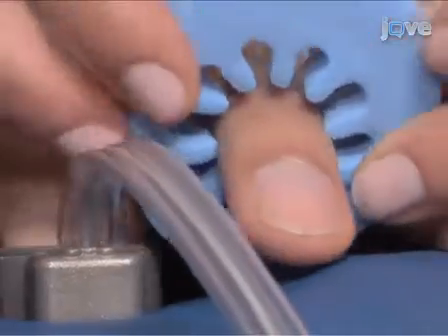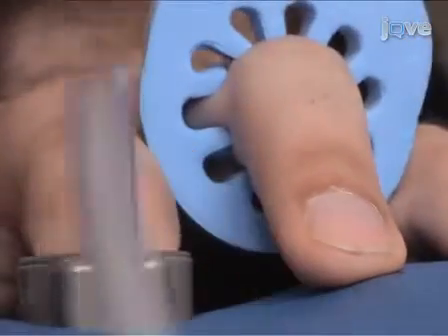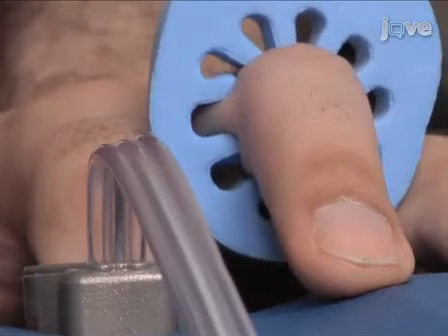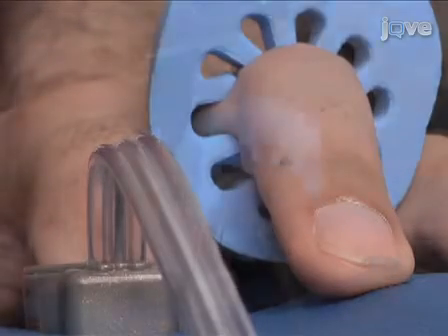Next, attach a foam anchor ring at the base of the middle finger to its very end and make sure that the foam ring and the PAT probe do not touch. Otherwise, the ring may mechanically interfere with the probe.